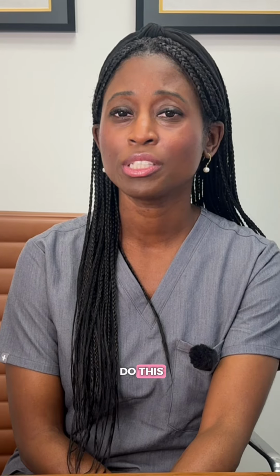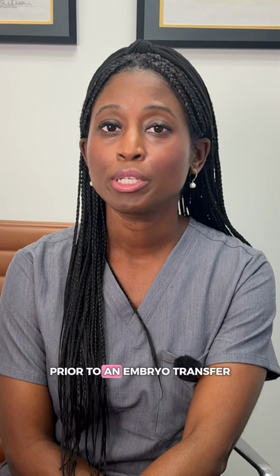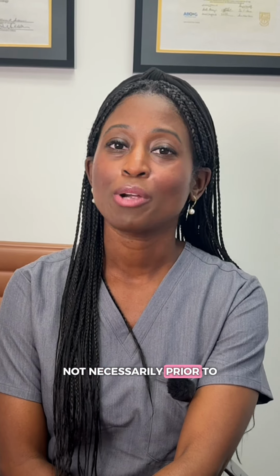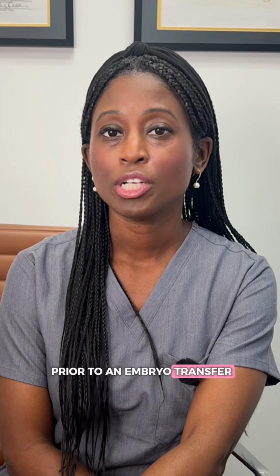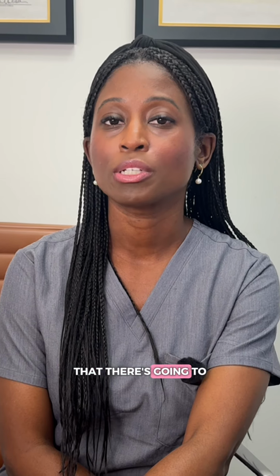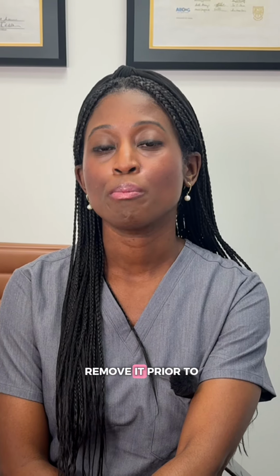How often should we do this? In general, most doctors do it every 1 to 2 years prior to an embryo transfer, not necessarily prior to an insemination cycle. Generally, we're doing it prior to an embryo transfer and we have a higher suspicion that there's going to be something abnormal found. What we're doing is trying to increase the chance of success that that embryo is going to implant. And if we see a lesion, we want to remove it prior to the transfer.